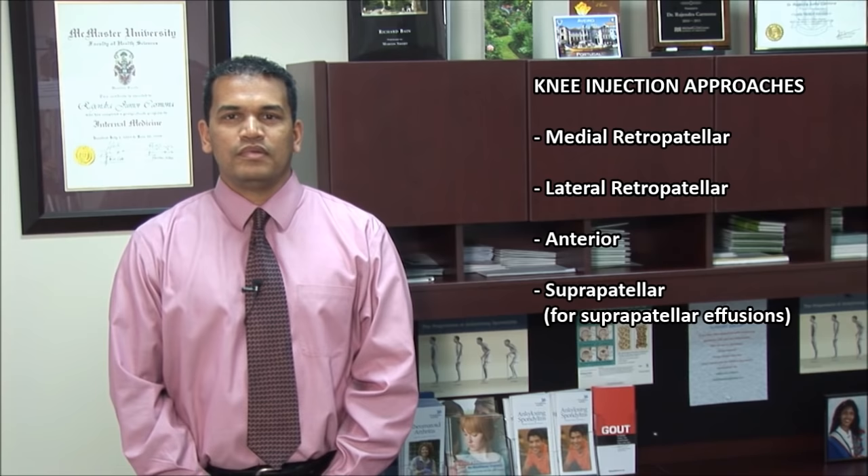There are four common approaches to aspirating or injecting the knee. These include the medial retropatella, lateral retropatella, anterior, and suprapatellar approaches.